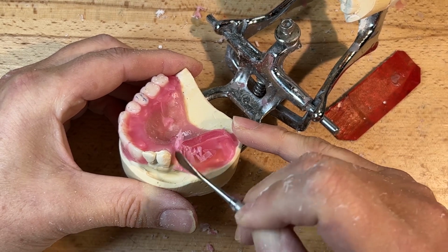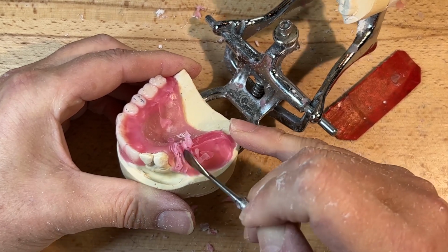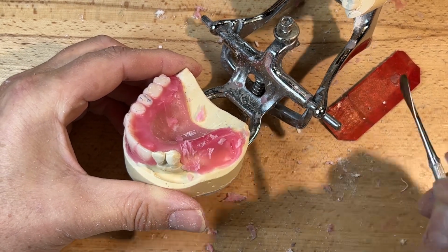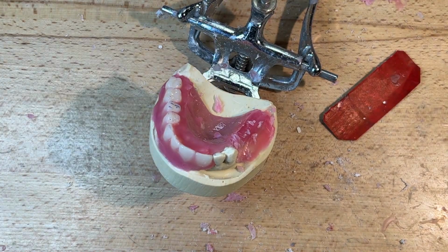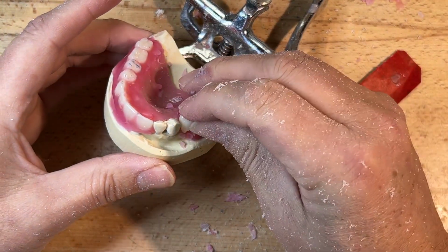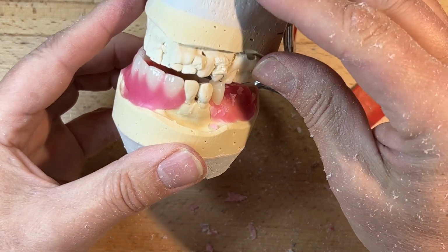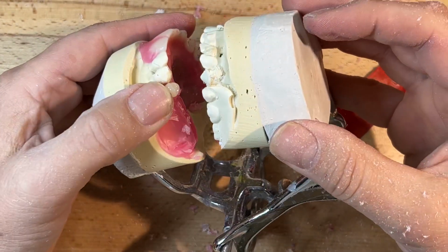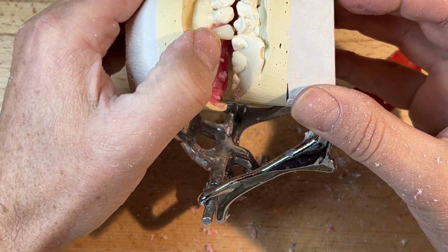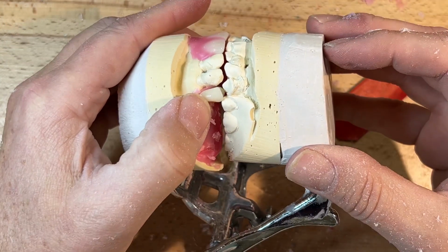I've got some light cure here. No, it's okay. We need to perform to maximum potential each time. And we don't have the experience other than just basic principles of occlusion that we apply each time. So I haven't really taken too much time to put this one, but I can see where I'm going to have to customize this occlusion in place here.